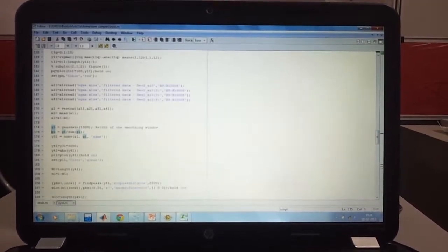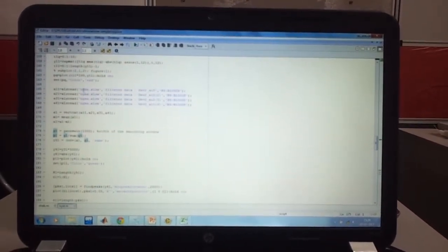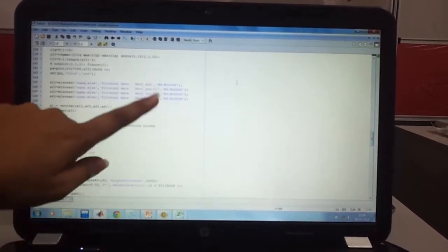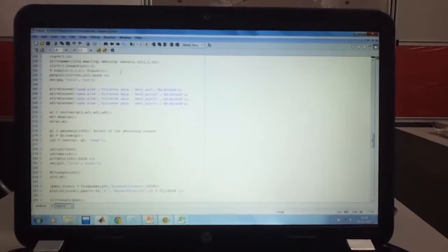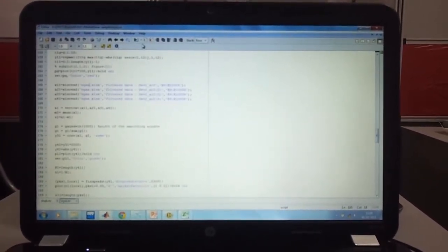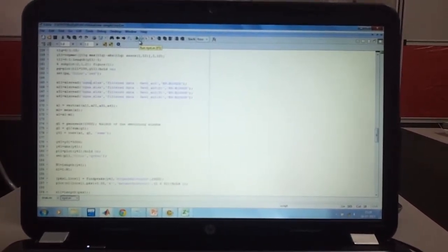I use MATLAB, where I can view this graph. I can view these files as a graph in a separate figure. Now I am going to run the program.